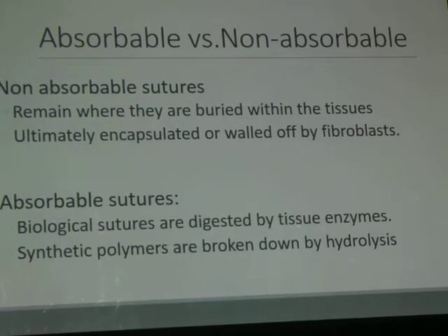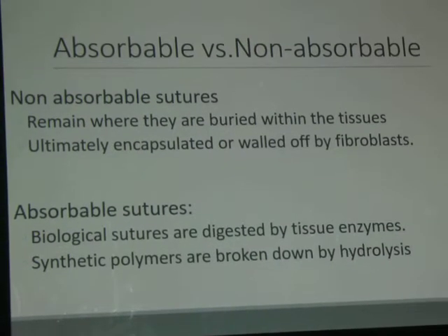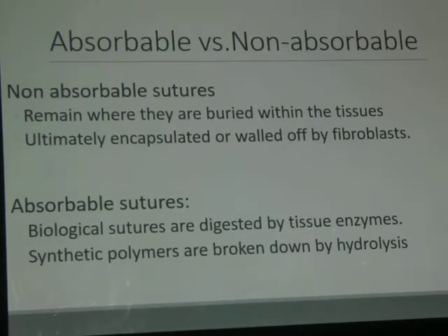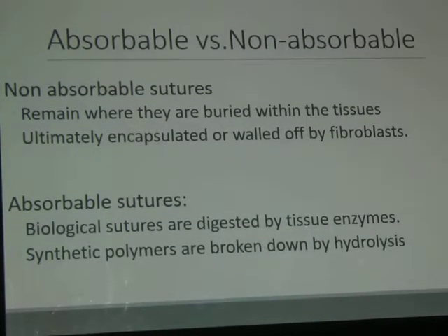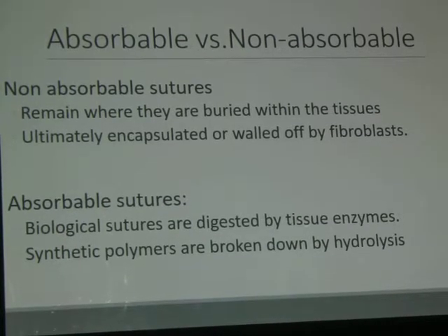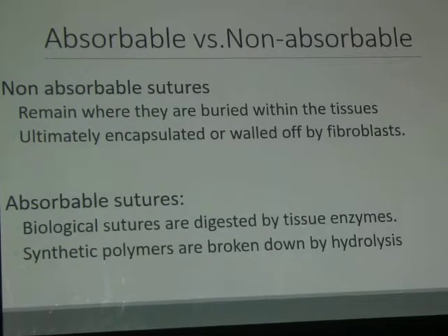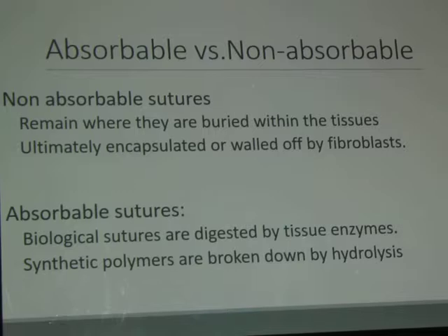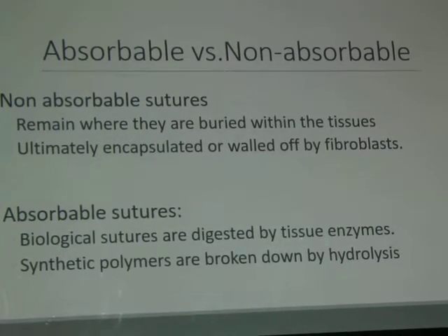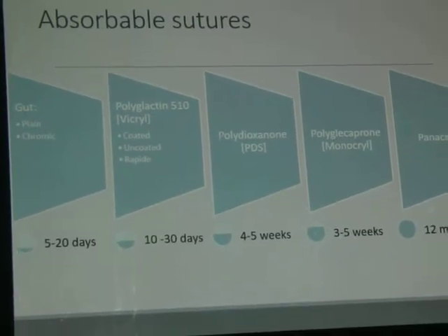أنا عندي الmucosa مثلا is a very rapidly healing tissue، يبقى أنا مش محتاج suture material تقعد مدة طويلة. Bone will take like forever, so I need a very long lasting type of suture. عندي مكان infected وعليه tension، يبقى أنا محتاج support مدة أطول، يبقى هختار suture يا permanent يا تاخد a very long time to be absorbed. فالاختيار هنا مهم على حسب النوع of tissue، على حسب الtension around the tissue and depending on what you need from this suture material.